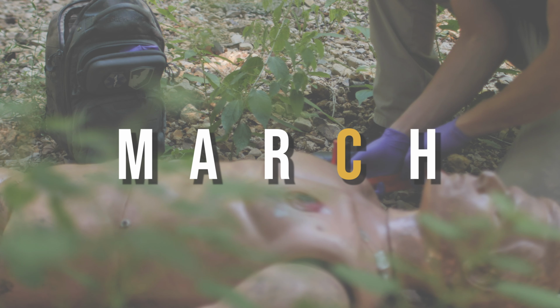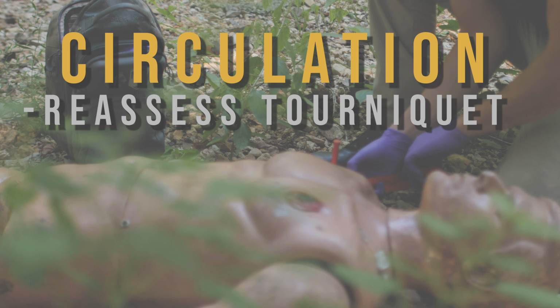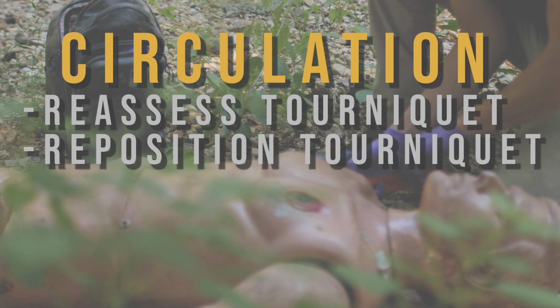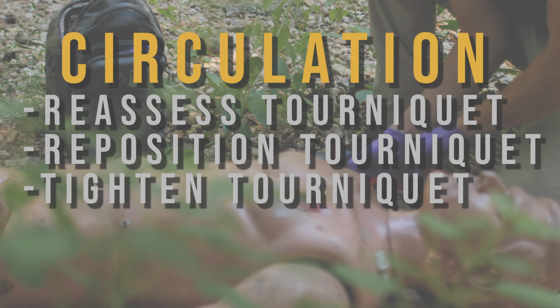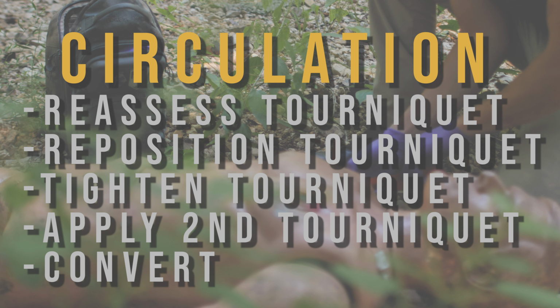When we get to C for circulation, we start reassessing some of that. So we need to assess what we've done. And specifically, we're gonna be talking about what we are doing with tourniquets. So we reassess tourniquets, we reposition those tourniquets if needed, tighten those tourniquets that were put in place, and then we will apply a second if needed, and then finally we will convert those tourniquets to wound packing if it's indicated to do so. So let's talk about assessment.